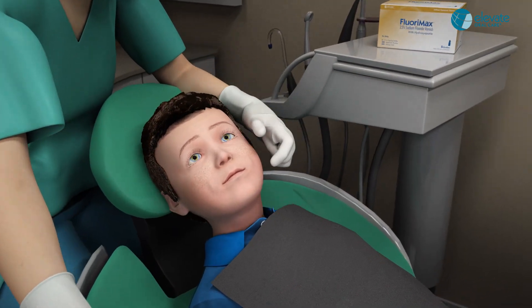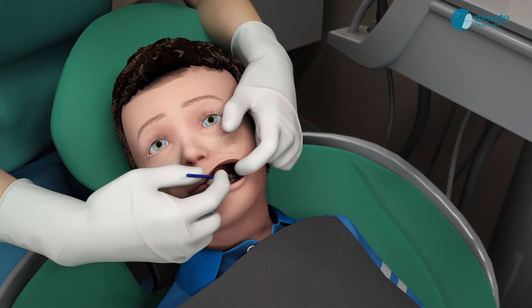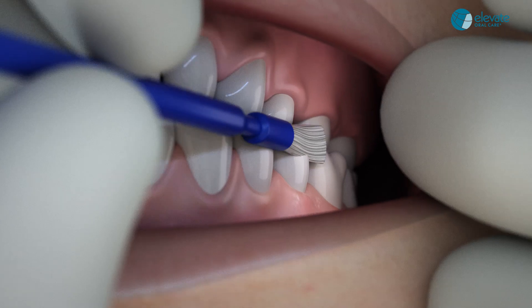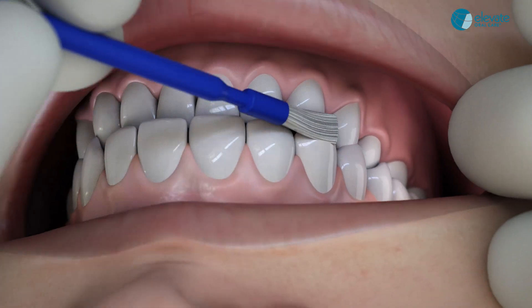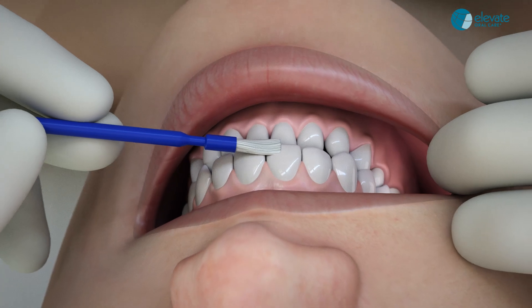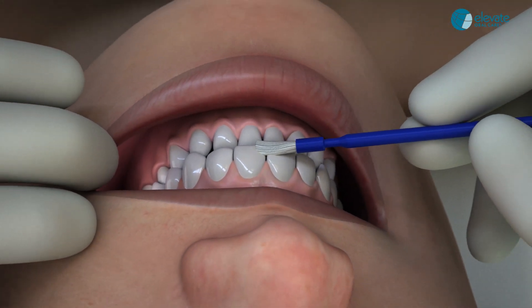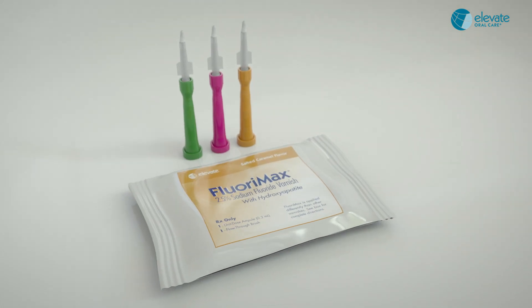For a pediatric dentition, have the patient bite together and paint one quick swipe on the bite line of the facial surfaces from posterior to anterior, allowing the bristles to touch both upper and lower teeth in one half of the mouth. Then repeat on the other side.